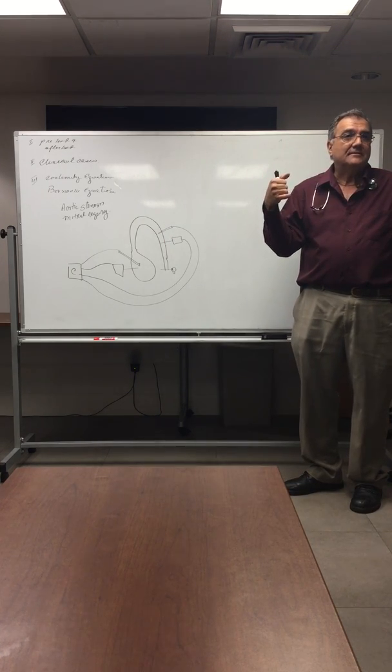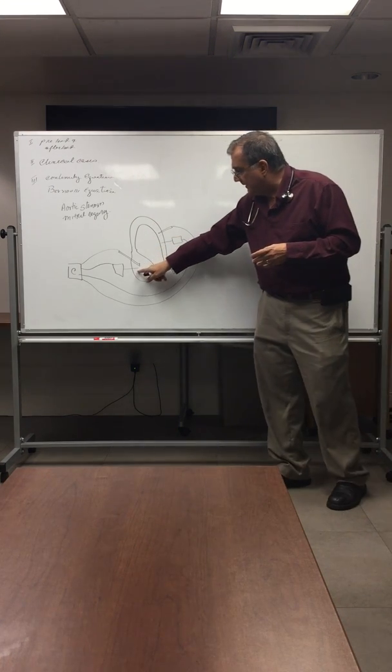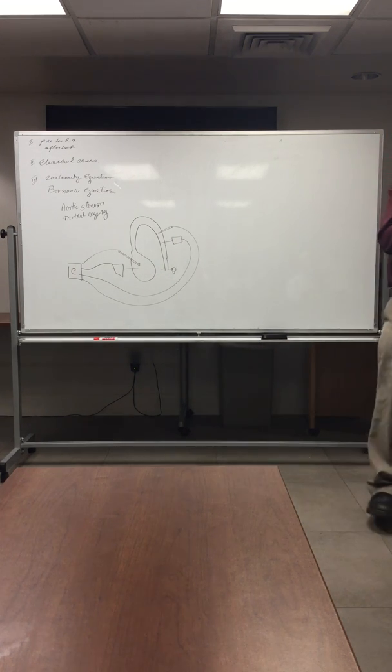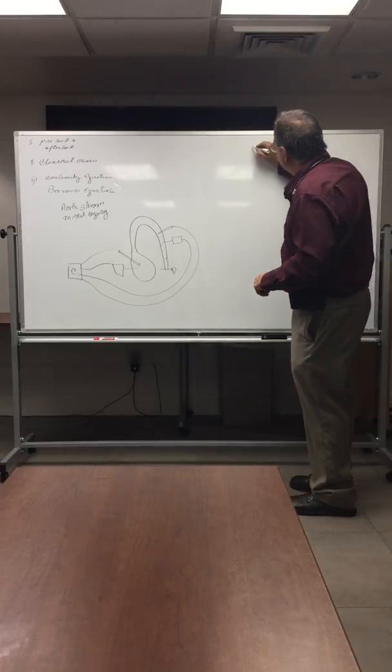They told the computer, when the heart contracts, we want you to either take blood out of the aorta really fast or pump blood into the aorta really fast, so you can control the pressure inside the aorta. By the same token, they told the computer, when we tell you and the heart contracts, we want you to either give it fluid, so you increase the wedge or the preload, or, if we tell you, take fluid out, so you decrease the wedge and the preload. And they began making a curve, and the curve looks something like this.